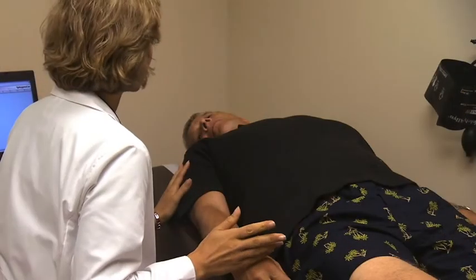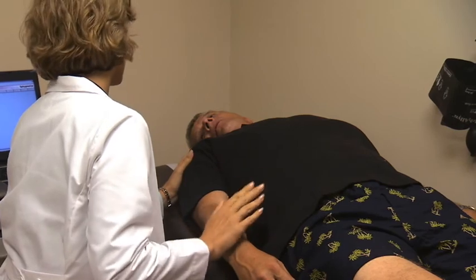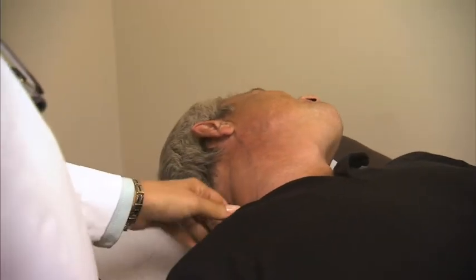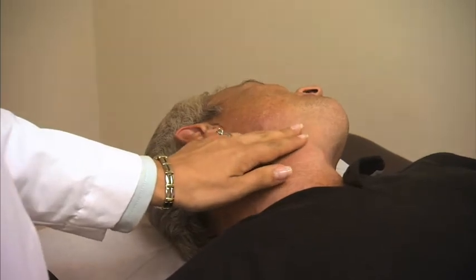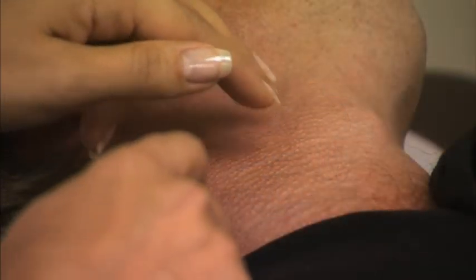Palpate and mark the pulses that will be used in performing the pulse wave velocity test. To find the carotid pulse, tilt the subject's head backwards and away from you, and use the tips of your fingers to locate the strongest pulse. Mark this location with a felt pen.